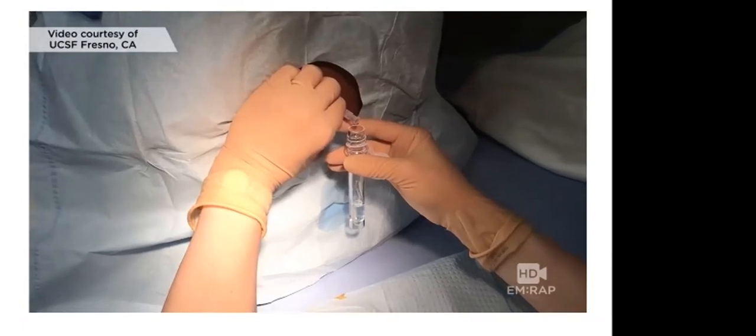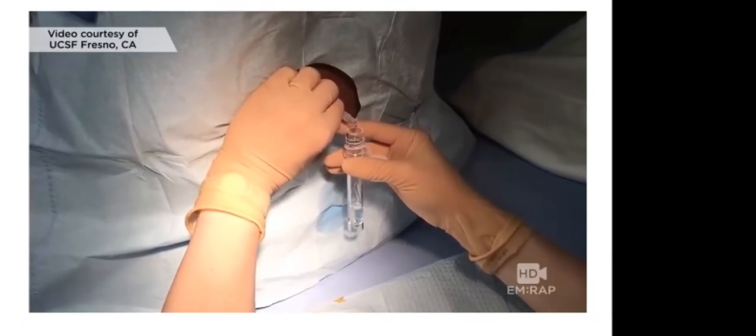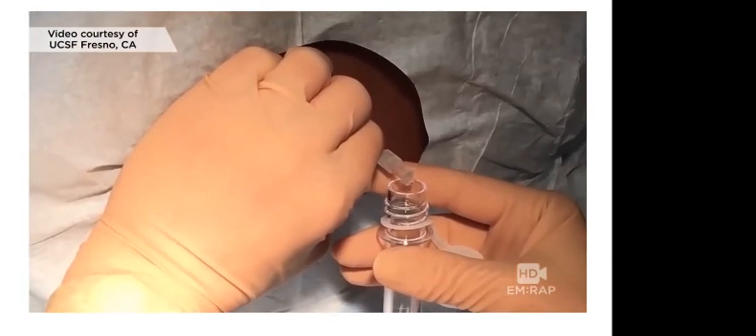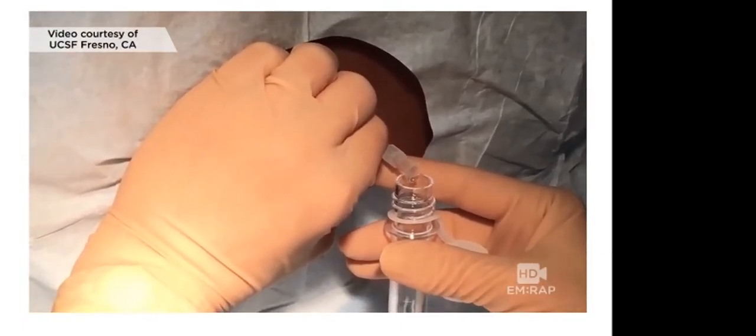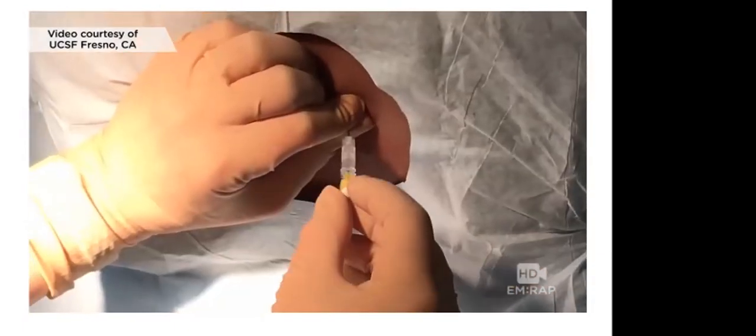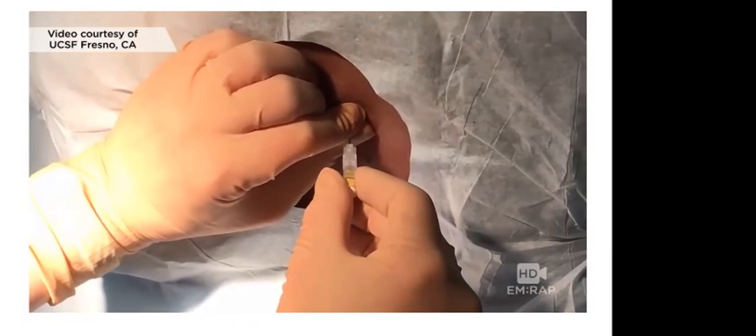This LP was pretty difficult, and we ended up having to sit him upright to get spinal fluid. Normal CSF is clear. Try to collect a few milliliters of spinal fluid in each tube for testing, and remember, don't aspirate spinal fluid. Replace the stylet before removing the needle.